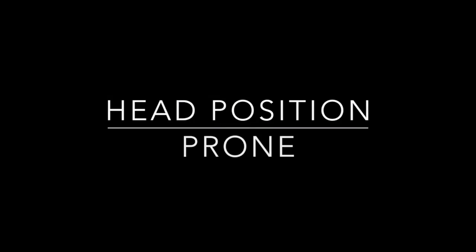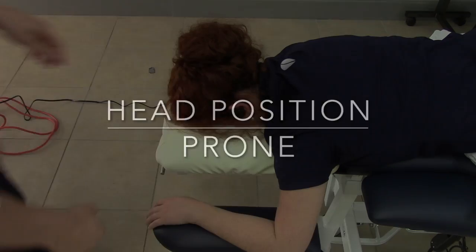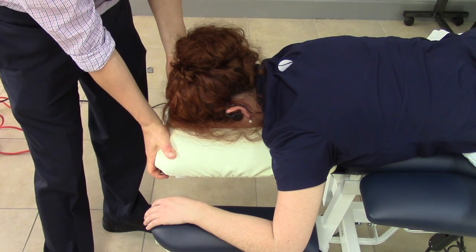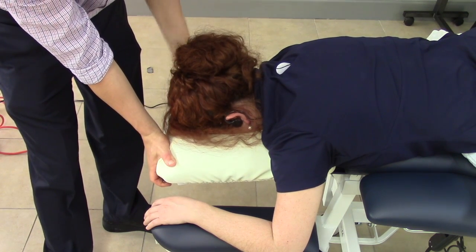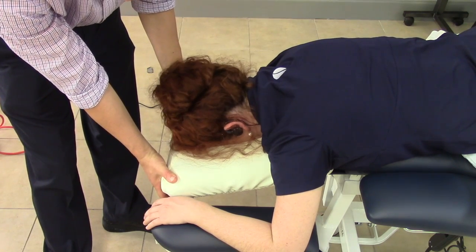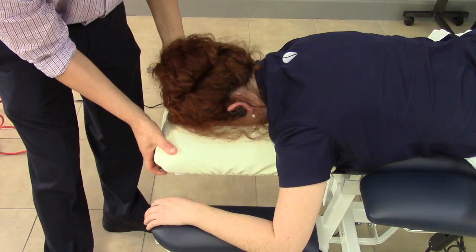When the patient is in prone, you can adjust the head position. The lever on the right raises and lowers the headpiece, allowing you to find the optimal comfort level for your guest.